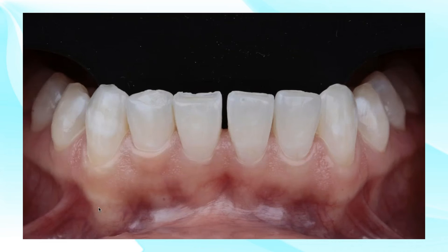Here's another picture of the lower. So this patient never paid attention to the lowers. She didn't really care about that diastema that she has right there. But once we took this photograph and showed her that, she said, you know what? I want to get that fixed. And I also want to get those chips fixed. So this is the importance of a contraster.